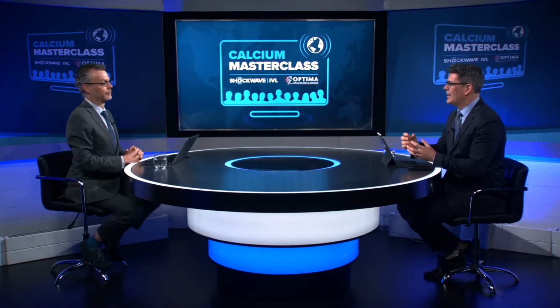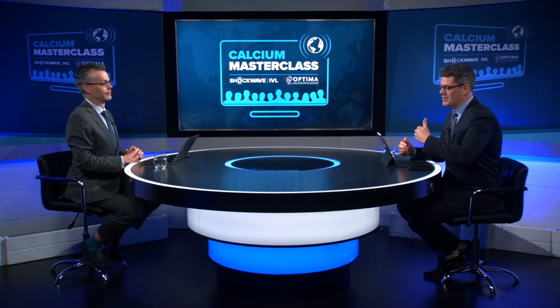I think there were two reasons for using OCT. One of them was to look at the mechanism of action. And really, as an intravascular imaging modality, OCT is ideally suited for that. It gives you a very high degree of spatial resolution, and you can image calcium very clearly, both by looking at concentricity as well as depth. You really only get the concentricity information from IVUS. You don't get the actual depth, because these sound waves do not penetrate into the deep calcium. It's only really with OCT that you can see that level of detail. So the first reason was to demonstrate the mechanism of action.